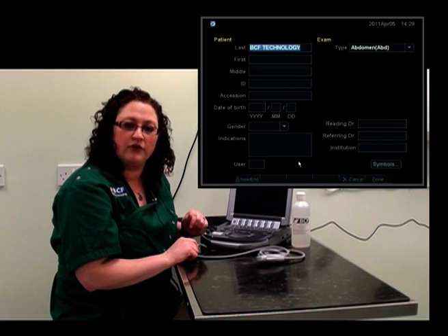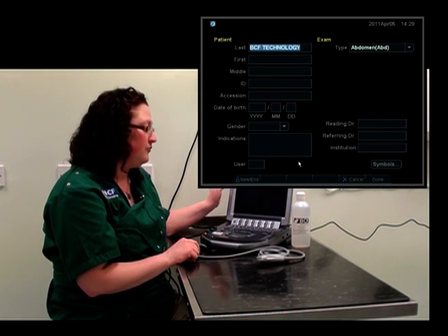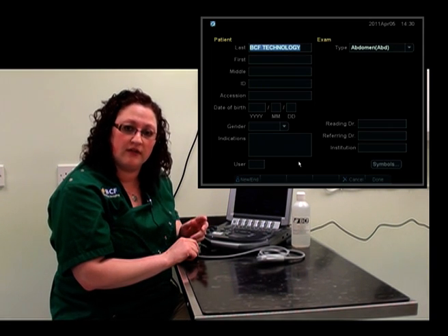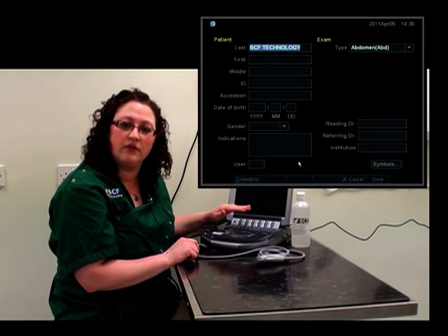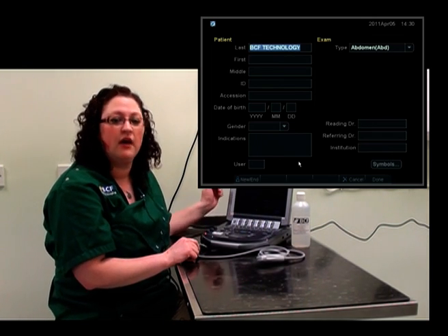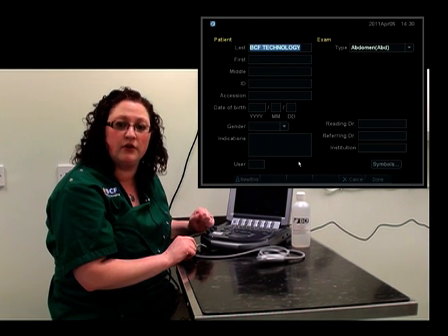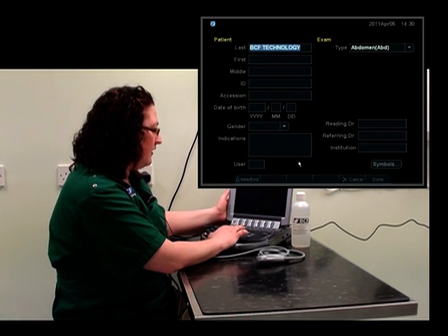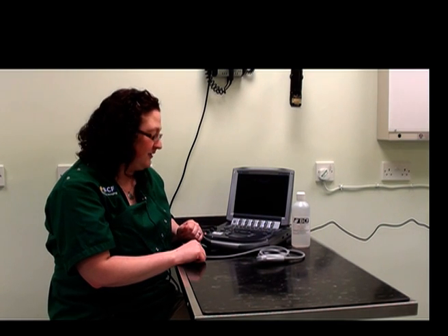Another thing you can also do while accessing the patient record is to put what type of exam you're going to be performing, whether that's a cardiac exam or in this case an abdominal exam. This will help the machine to set up presets for the monitor and some of the buttons throughout the exam, just to make it a little easier for you. We've set this up and we're ready to get started.